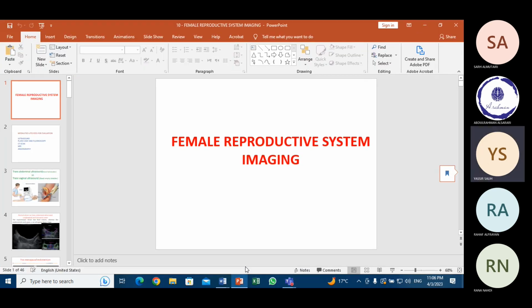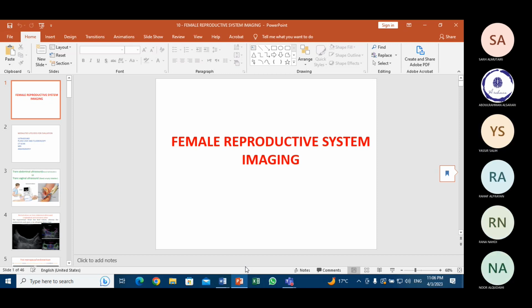Today, inshallah, I will present the imaging of the female reproductive system, in which we are going to explain the different imaging modalities commonly involved in assessment of this system, and the normal appearance of the female reproductive organs.